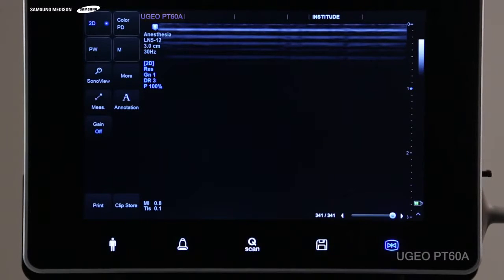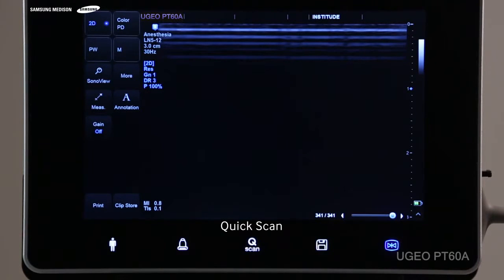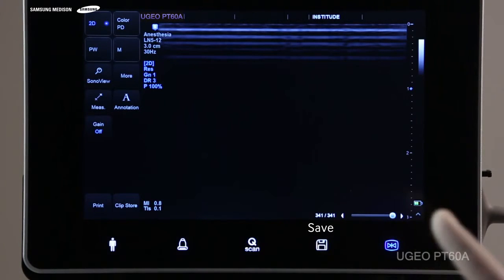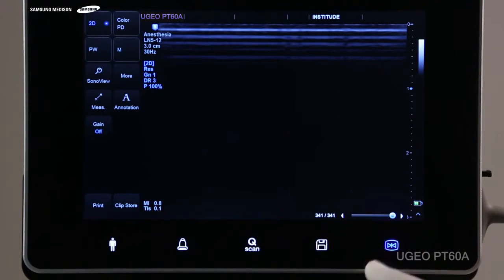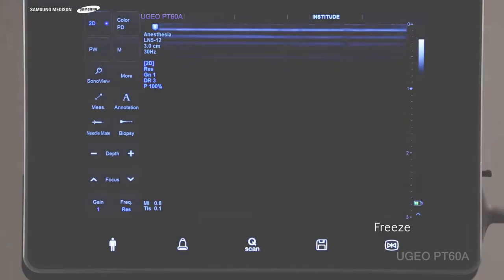The third key is for quick scan, which allows for quick optimization of settings for your scan. While you're scanning, you can save images or cines by simply pressing this fourth save key. You can also freeze and unfreeze your image by pressing this last freeze key.